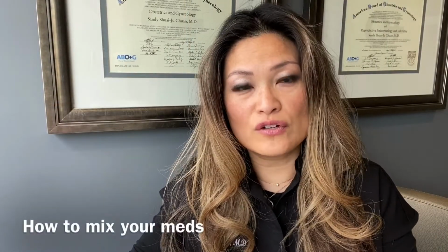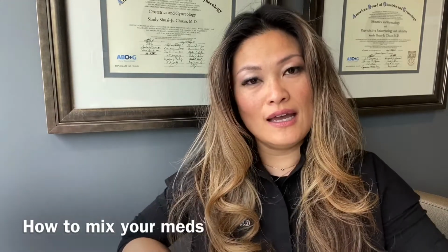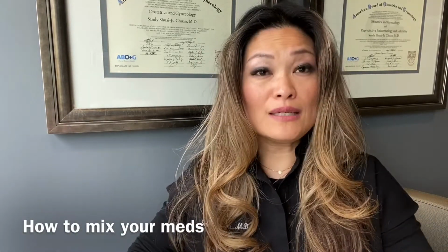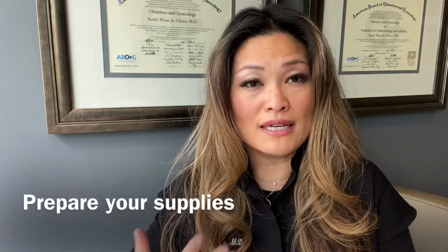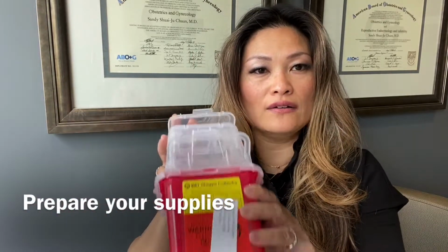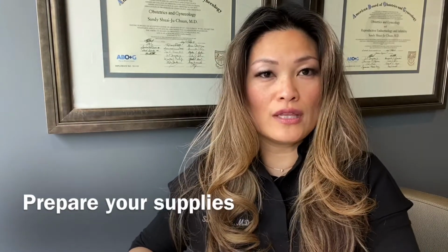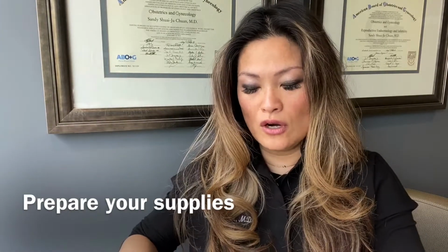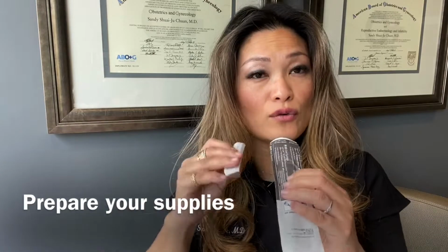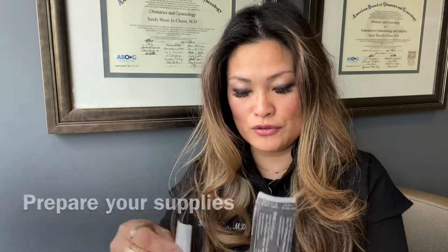So now let's go over how to mix your medications. We will start with Menopur and Gonal-F, which are the medications you'll be starting with first, okay? So basically, before you start your injections and mixing them, I always tell my patients to get everything ready. So you'll want to make sure that you have your sharps container close by so you can dispose of any needles. You want to make sure that you have alcohol swabs. You also want to make sure that you have any of the syringes and needles that the clinic or the pharmacy gave you, so that you can have them ready there and available to use, okay?